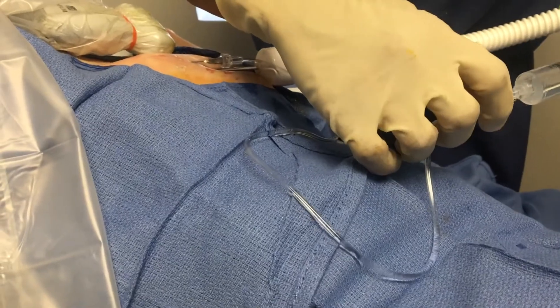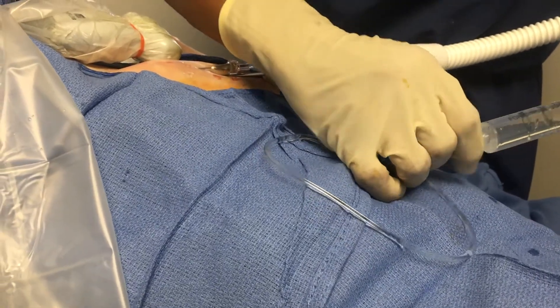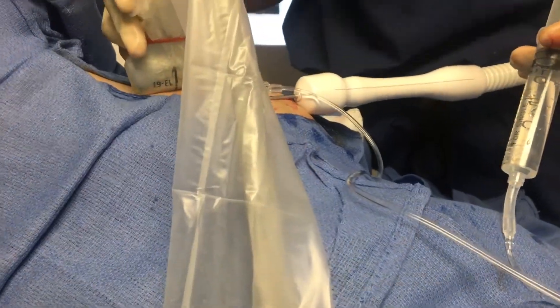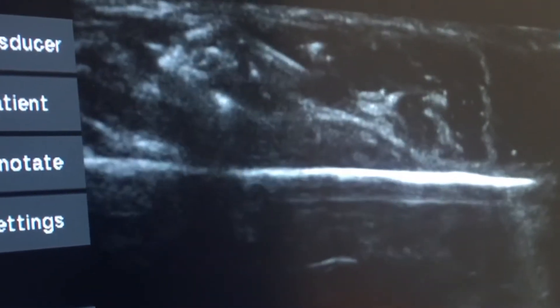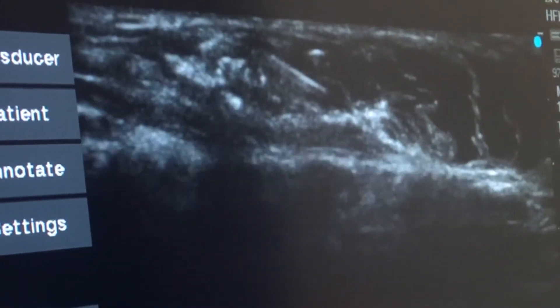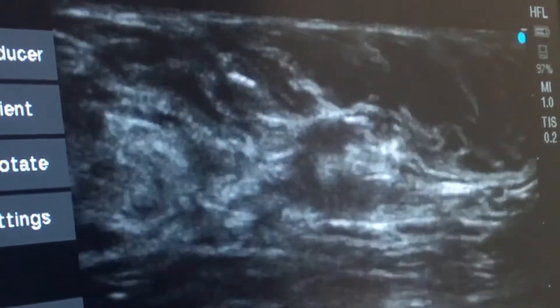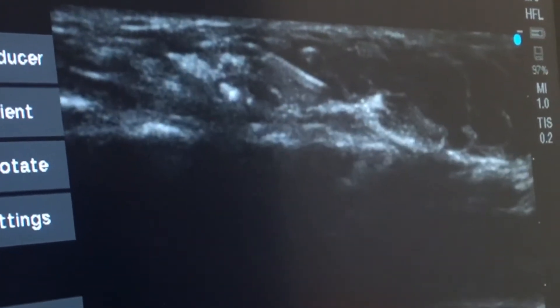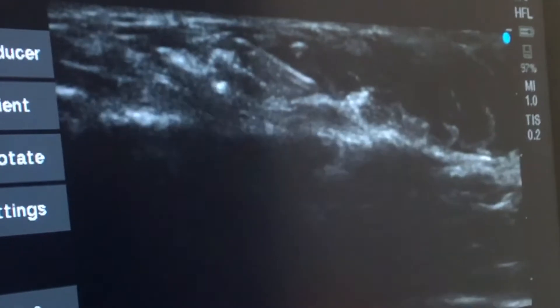To protect the skin from freezing, a catheter containing saline is set up, which can be injected under the skin to protect it from the underlying ice ball. The first of two freeze-thaw cycles begins. The first sign of ice formation is that the ultrasound image begins to turn dark, initially under the cryoprobe and then on top of the cryoprobe as the ice ball expands to surround the cancer.